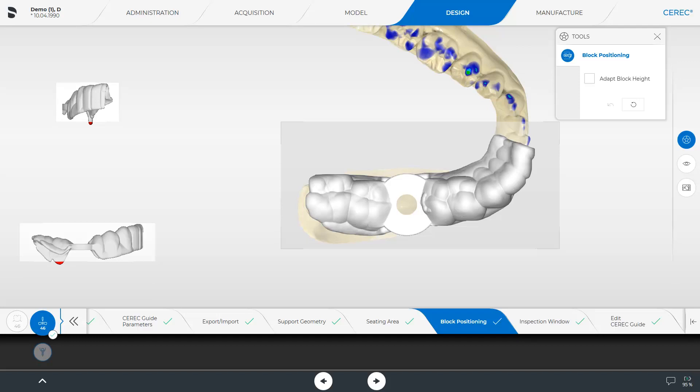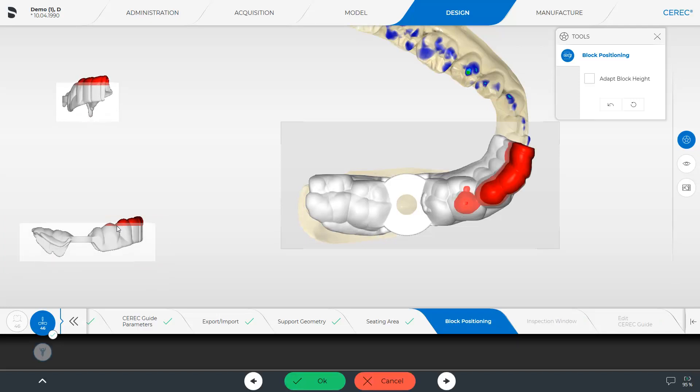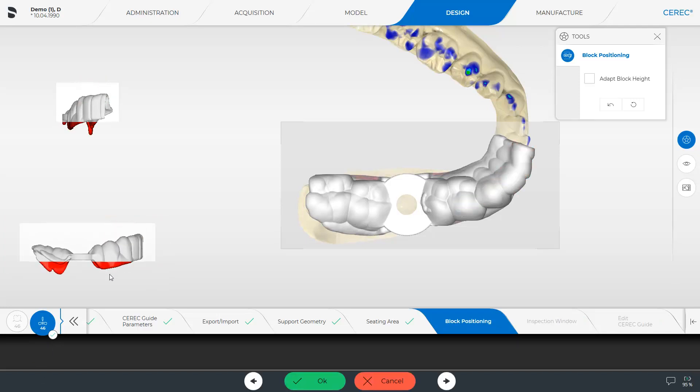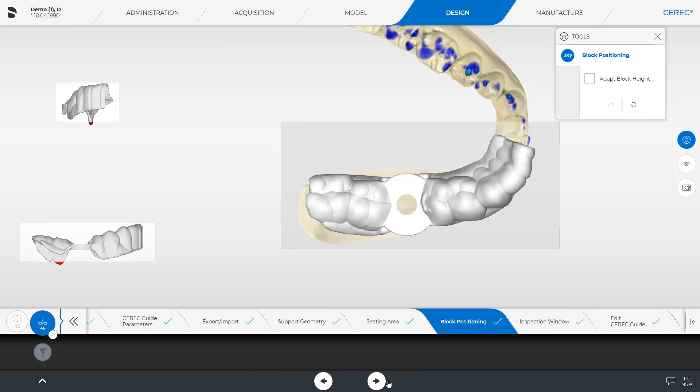As an example, we move the guide in the buccal view. Using the areas marked in red, you can see when the guide is no longer positioned within the block, and would therefore be cut off or not milled at these points. This time, we discard the changes and click Cancel. Now the guide is back in the position suggested by the software, and we switch to the next step, Inspection Window.